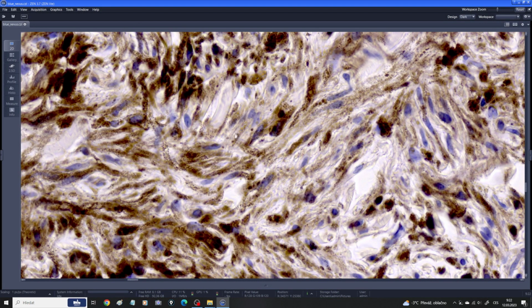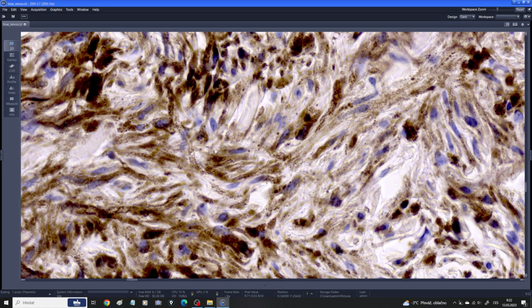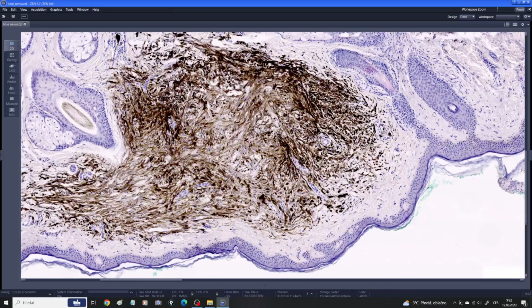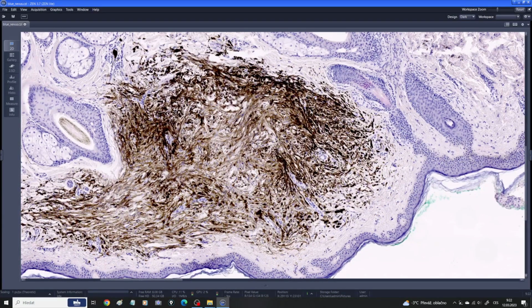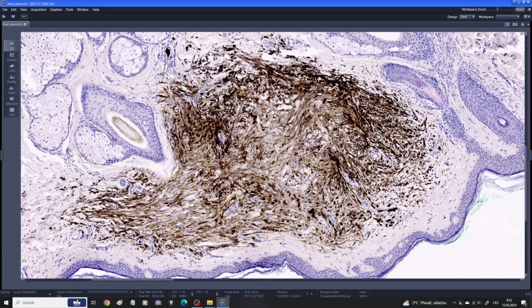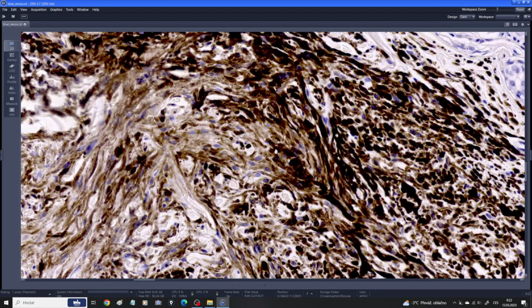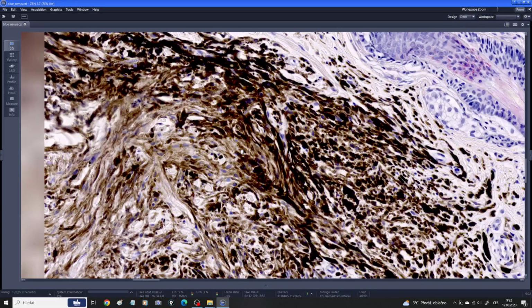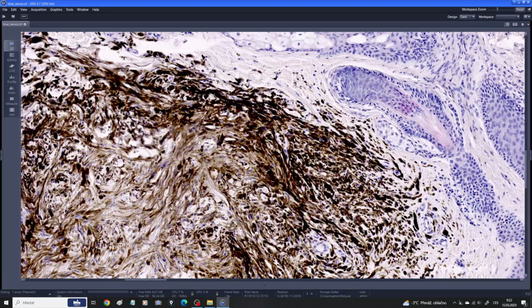And in case of blue nevus, they are more elongated and they are spindle-shaped. And the second quite common and typical feature is this massive hyperpigmentation. Look how black it is. There is a massive deposition of melanin, and this is quite typical for blue nevus. Very often the pigmentation can be so dense that we don't see the cells anymore, and very often we need to use some special histological techniques to get rid of the melanin.